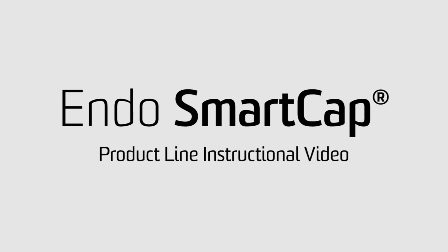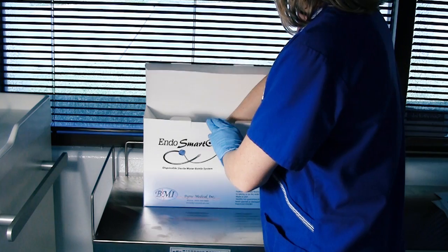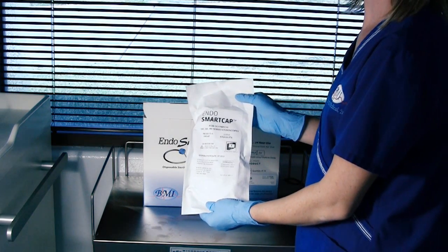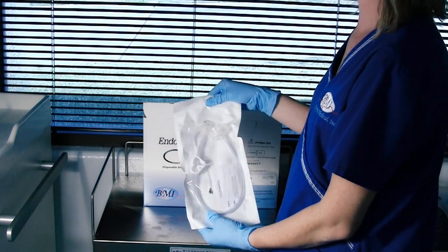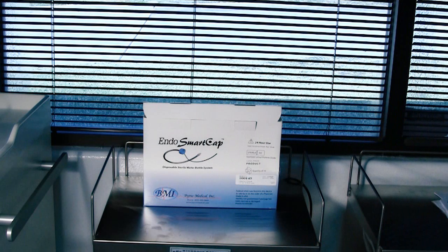The Endo Smart Cap is a multi-use disposable water bottle system. After assembly, each unit is sealed in a Tyvek pouch and sterilized using ethylene oxide. Each pouch consists of one Smart Cap and a date and time sticker to be filled out upon opening of the package. All Smart Caps are purchased by the box, shown here with 10 units in each box.